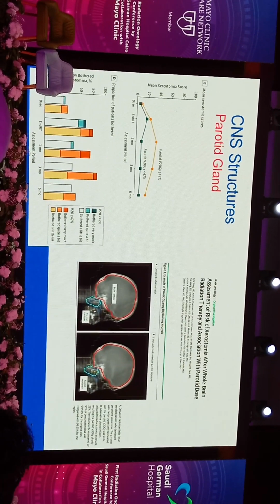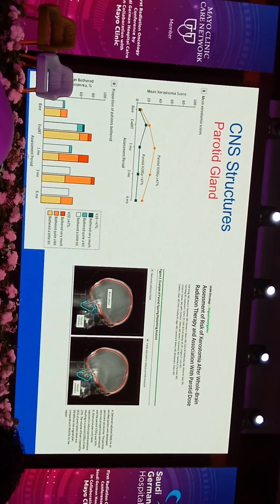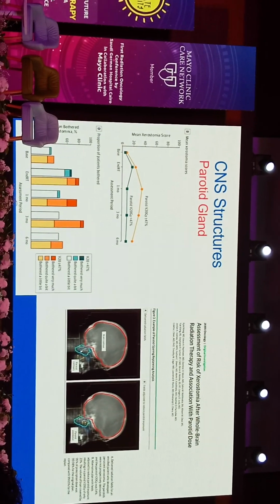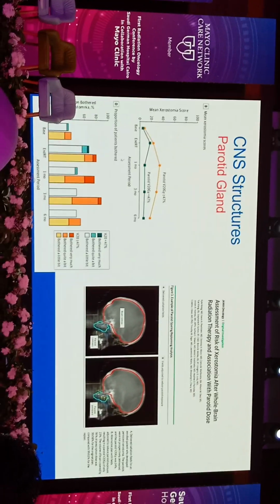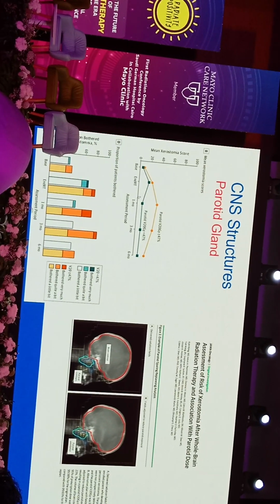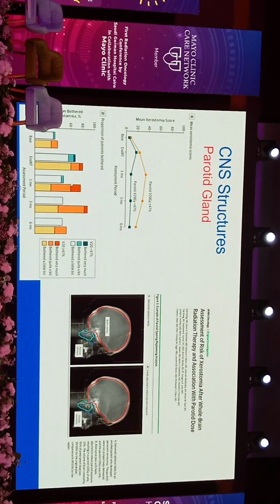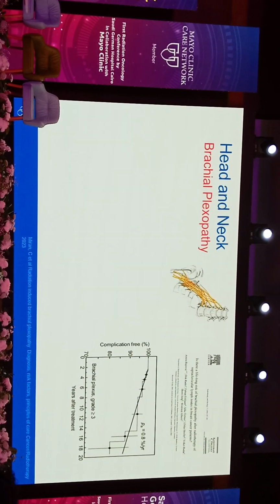Even the parotid gland should be contoured in whole brain radiation therapy. Higher doses to the parotid, whether intentionally or by not considering it in terms of a lack of contouring, such as a V20 less than 47% or more than 47%, resulted in differences in xerostomia, as well as patients being more or less bothered. The brachial plexus is another example.